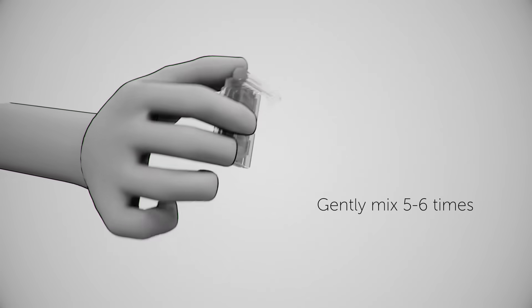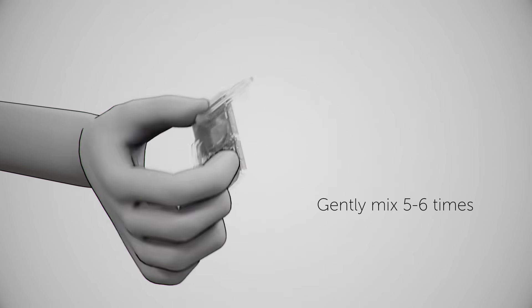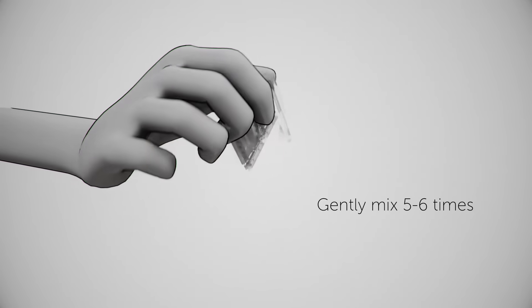Gently mix by turning the reagent pack back and forth five to six times before applying the blood sample. Do not shake.